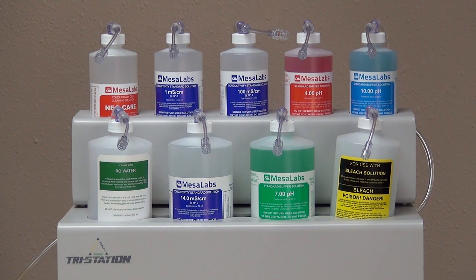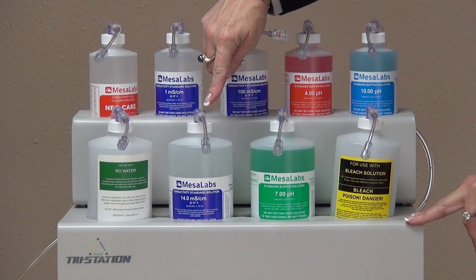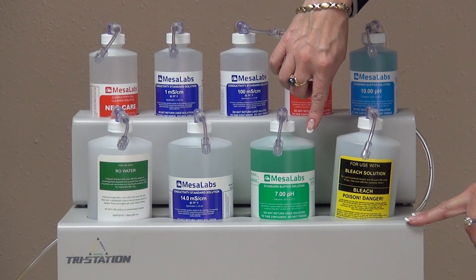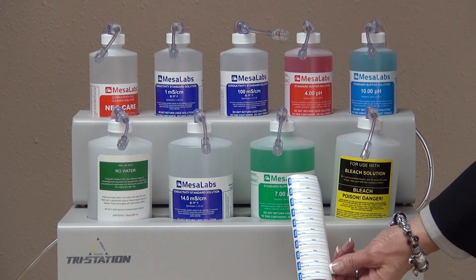Materials needed for the Level 1 calibration will include the Phoenix Meter, as well as a TriStation or SuperStation, the NIST traceable sodium chloride 14.0 conductivity solution, as well as the 7.0 pH buffer solution. When completed, you will need some calibration labels.